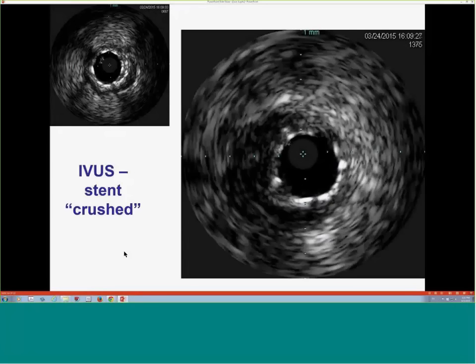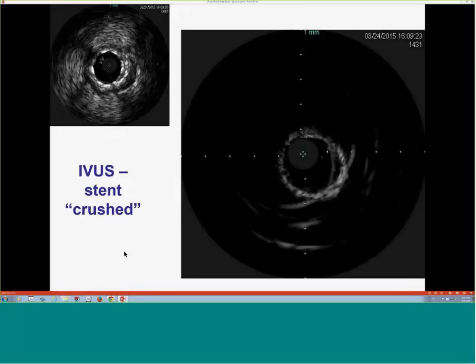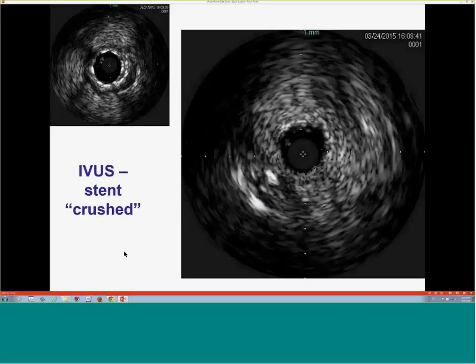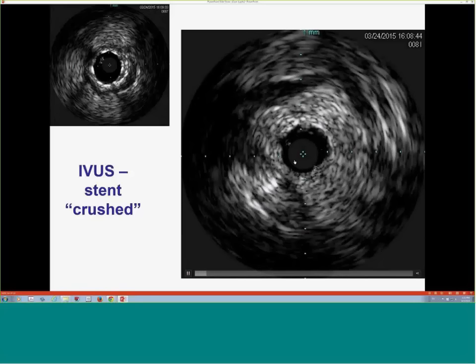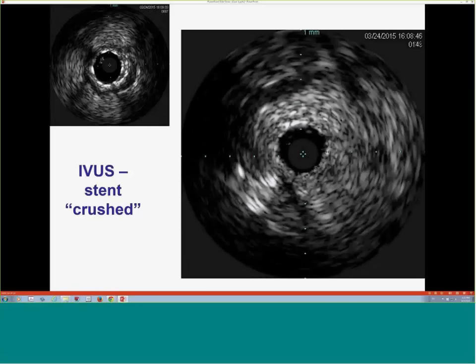Obviously, we don't have them. But once you have all these stent layers, and assuming that the bioabsorbable stent has decent radial strength to withstand this, I think the next step would be to put in bioabsorbable. Then at the end, you still have some more space left there.